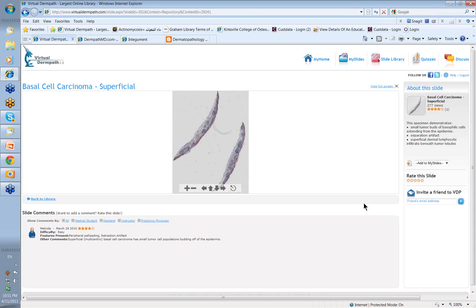Now, what other types of BCCs might we see? Well, let's have a look at, say, the nodular BCC.